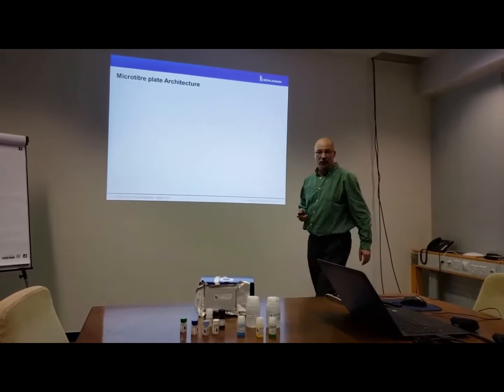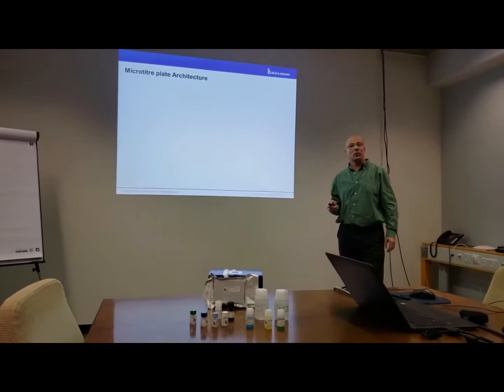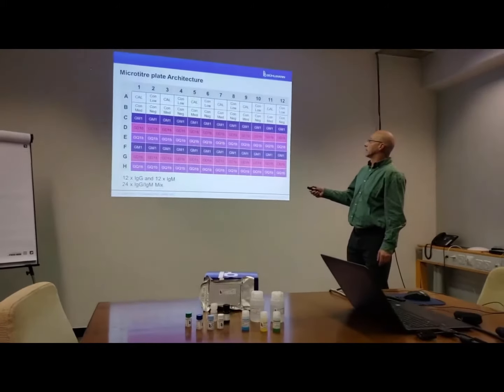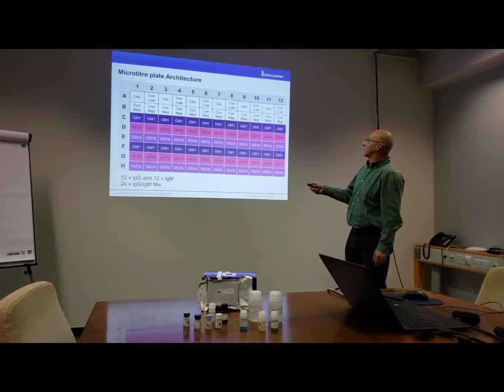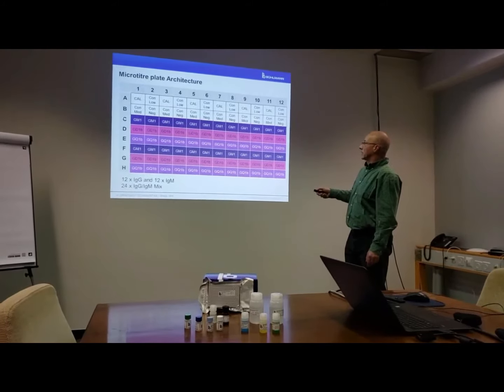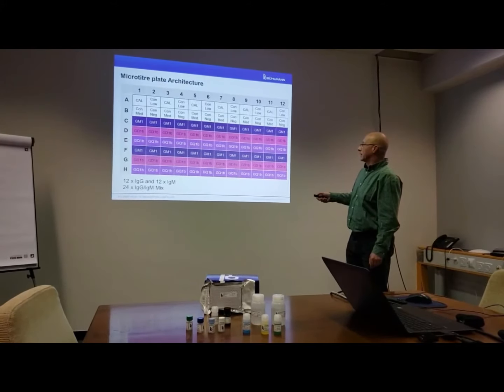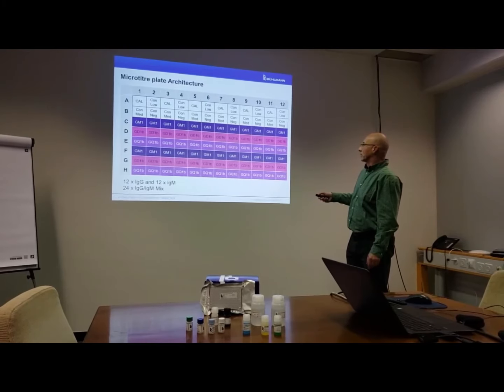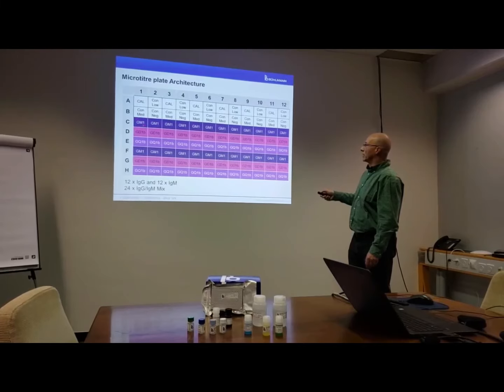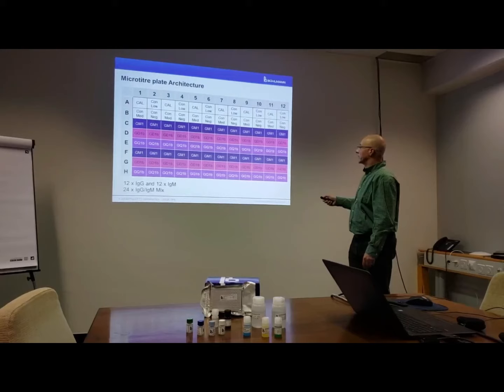And now I would like to explain to you the microtiter plate architecture of a Bühlmann GanglioCombi Light ELISA test. You see here the plate with 12 columns, and here in A and B, and in C, D, and E, horizontal-wise, are different gangliosides, GM1, GD1B, and GQ1B.